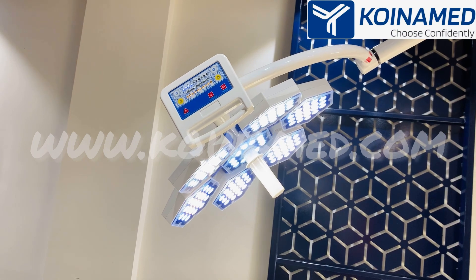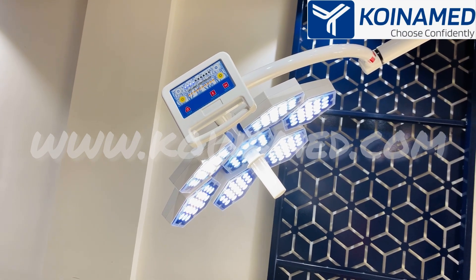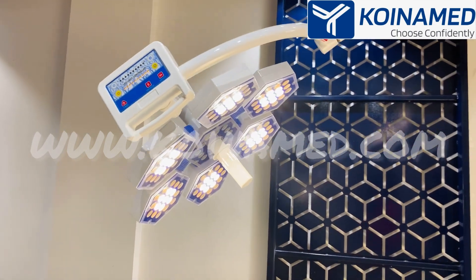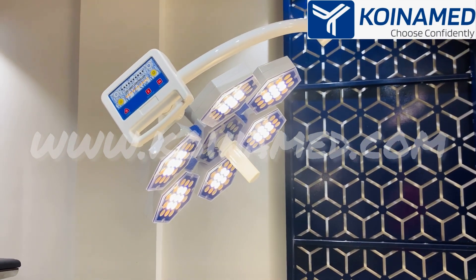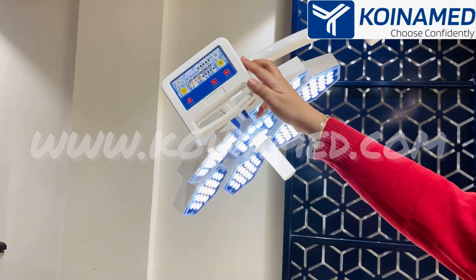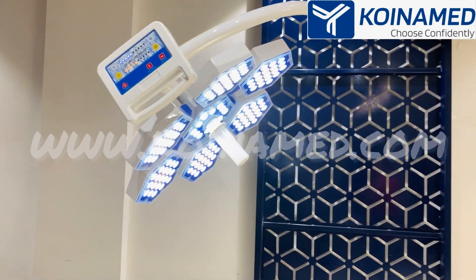The options we have provided are the endo mode and memory. When you press the endo mode, only the yellow light will be lit up on the dome. When you press the memory function, 50% white light and 50% yellow light will be available on the dome.